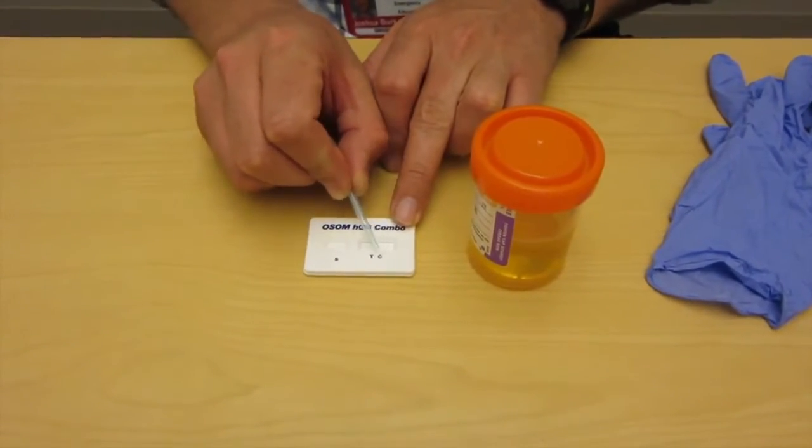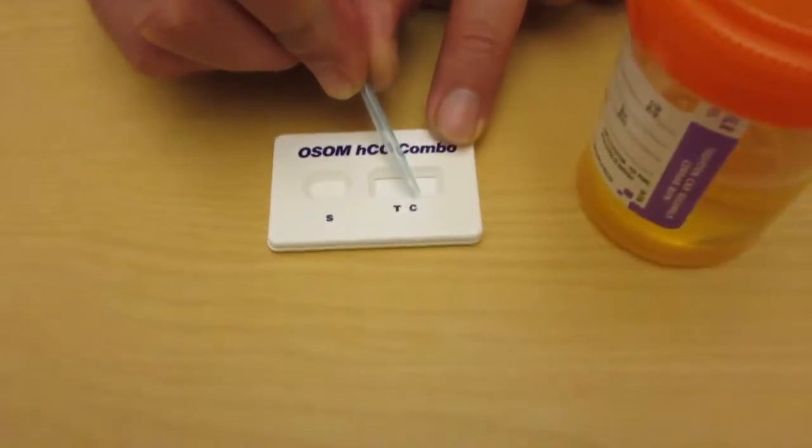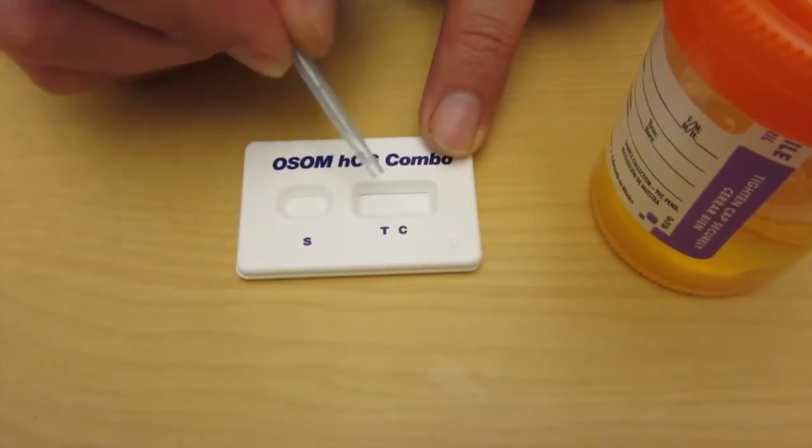We have the actual test cartridge itself. We have a sample well. We have a T and a C that you might notice here. The C stands for control. You have to always have a line there. And a T is the test.